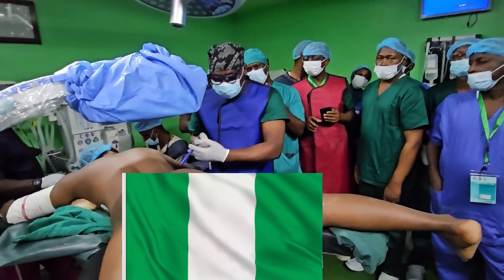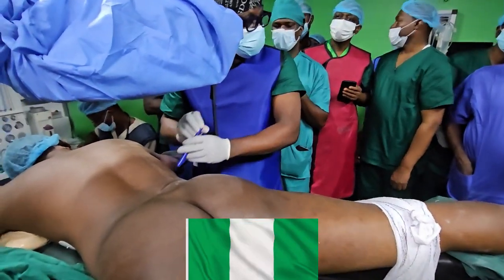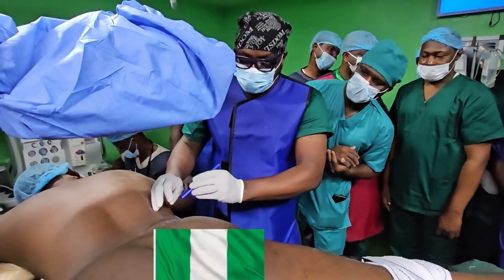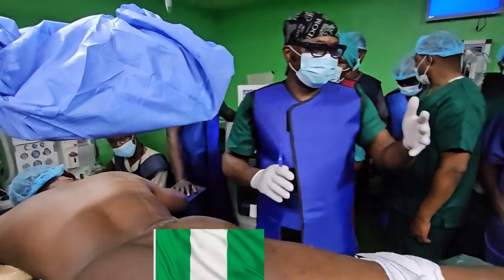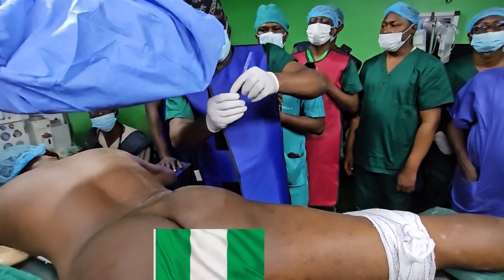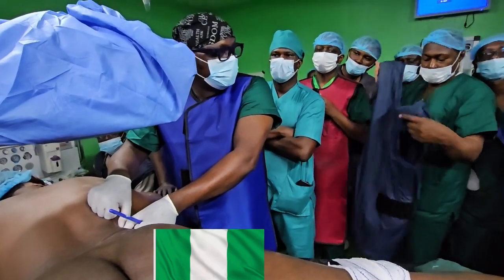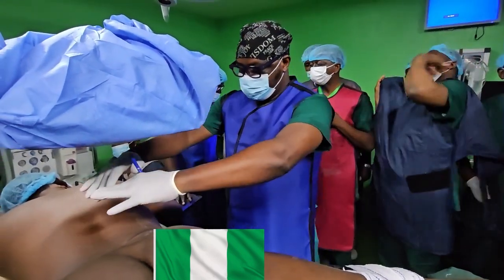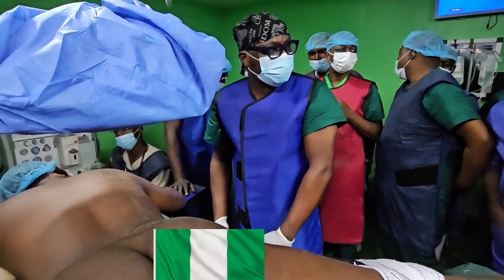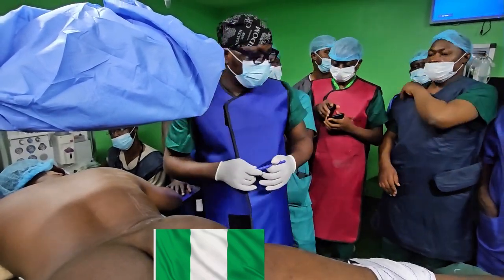So I will do my puncture. Once I get the puncture right, I will dilate. Once I dilate, I'll put the amplats. Once I put the amplats and the guide wire, I will then get a fresh broad drape that I will pass. I will make a hole in it and spread it over. Let it fit snugly around the access sheet. I will fold it around so that the fluid I'm making will be coming straight into the bucket so that I don't flood everywhere with irrigation fluid. So that's good.